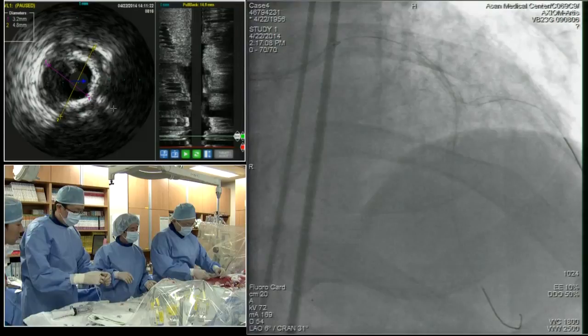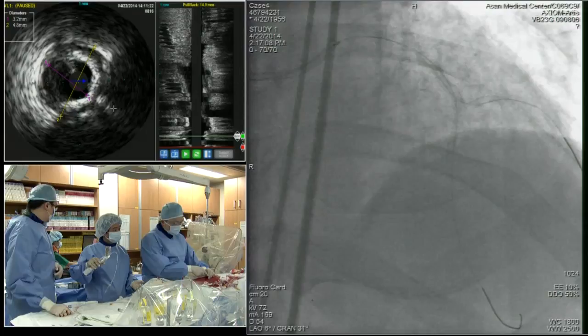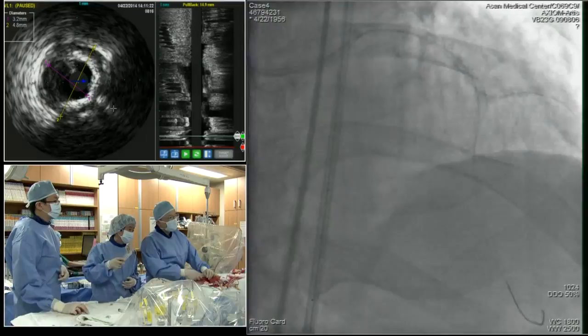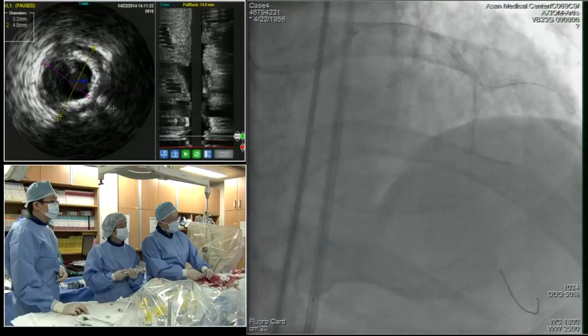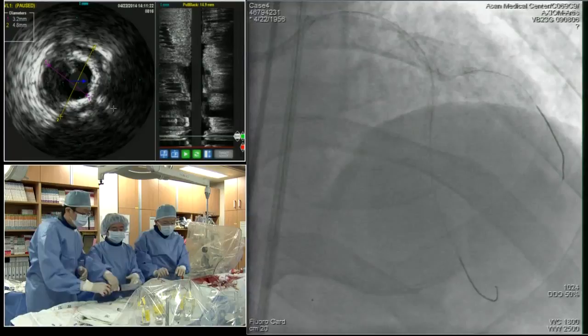I have one question to Ochiai-sensei. Current situation, I think diagonal ostium stent apposition is not so good. Of course, because you crushed. So balloon dilatation is, I think, necessary. But if nothing can pass, nobody can do. It's just not smooth to pass through this guide wire. So I hope, don't you try? Okay. But first I try Corsair, because I don't strongly believe in balloon.